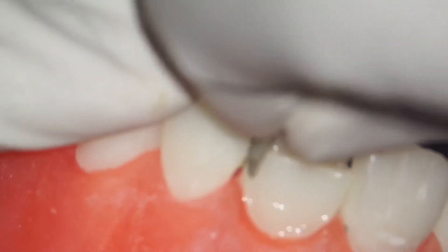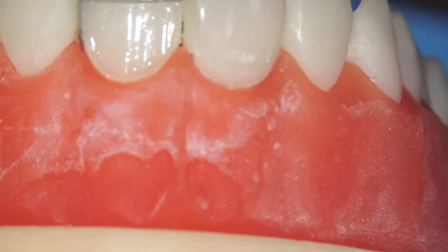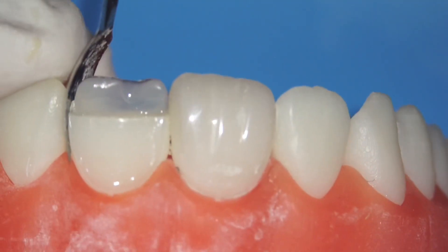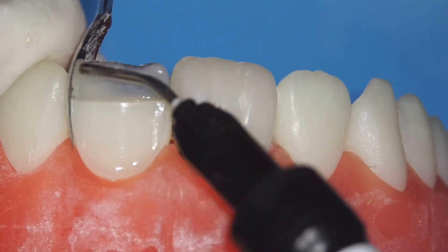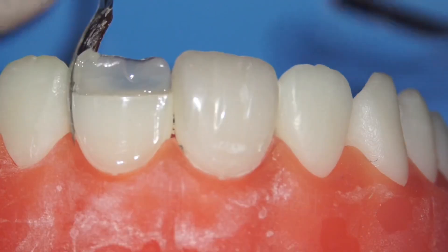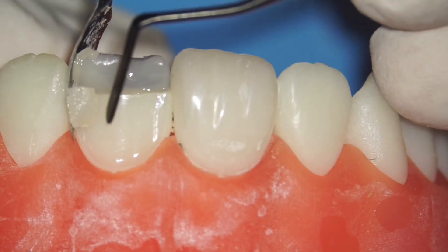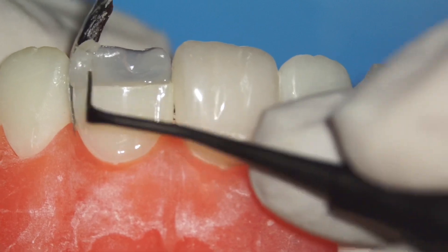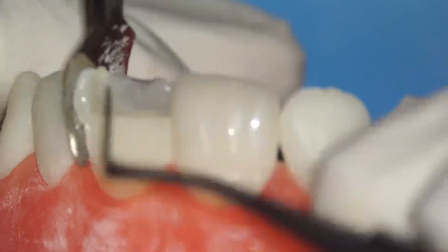For the proximal wall I usually use a metallic matrix — this is a spoon matrix. I do one wall at a time. In this case you can see my palatal wall was slightly deficient, so I'm adding a bit of flowable and then packable composite. The wall shouldn't be more than 1 mm thick; if it's too thick the shape will be off — I'm going to use just about 0.5 mm.